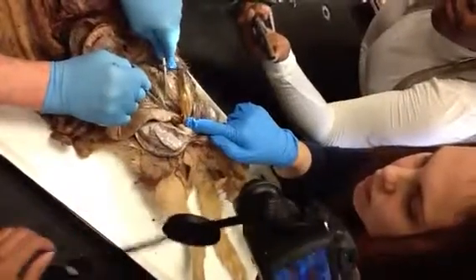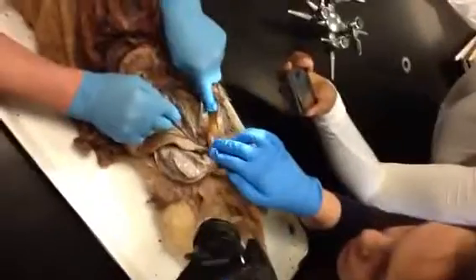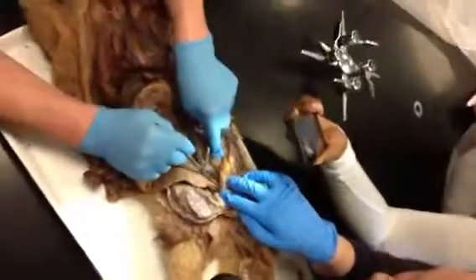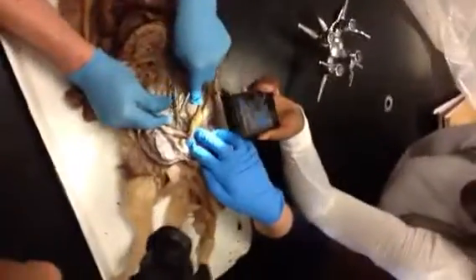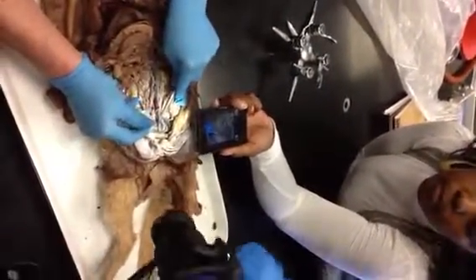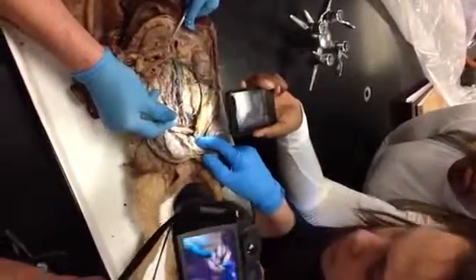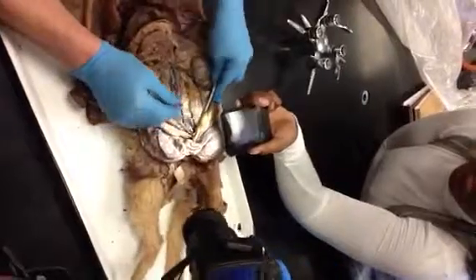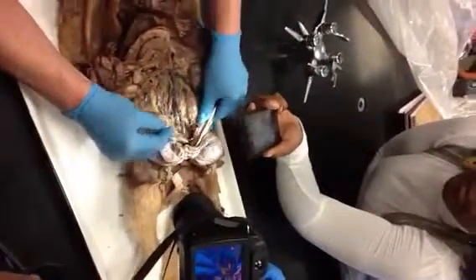So the first thing I find is going to be the median sacral, and I can see it way down here. Right there. I've got it on my probe. That's median sacral or caudal. Then anything after that, and I'm looking in, I can see it.